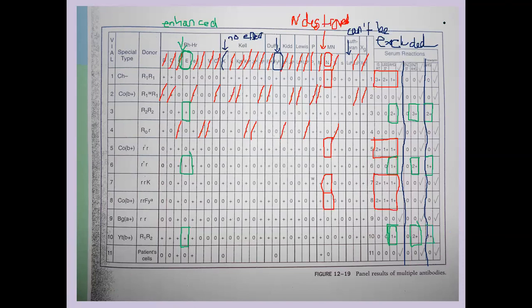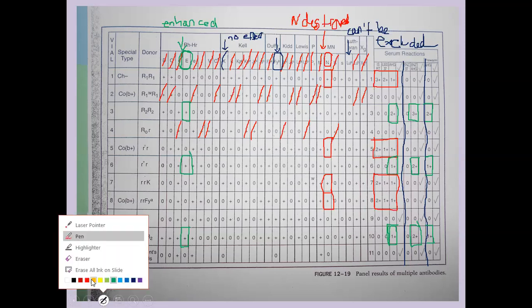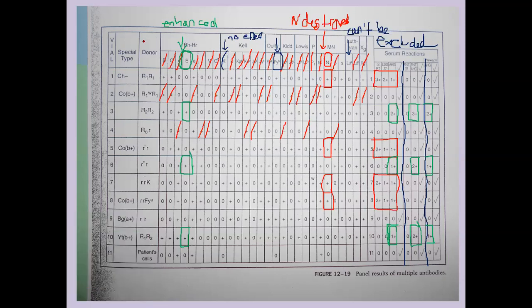So we can see pre-warming basically eliminated the reactions from the anti-N. Okay, so what does this mean as far as transfusion for this patient? To this point, we don't need to consider their anti-N as being affected with transfused red cells, okay? So we talked about this previously in, I think, lecture 10 and 11.